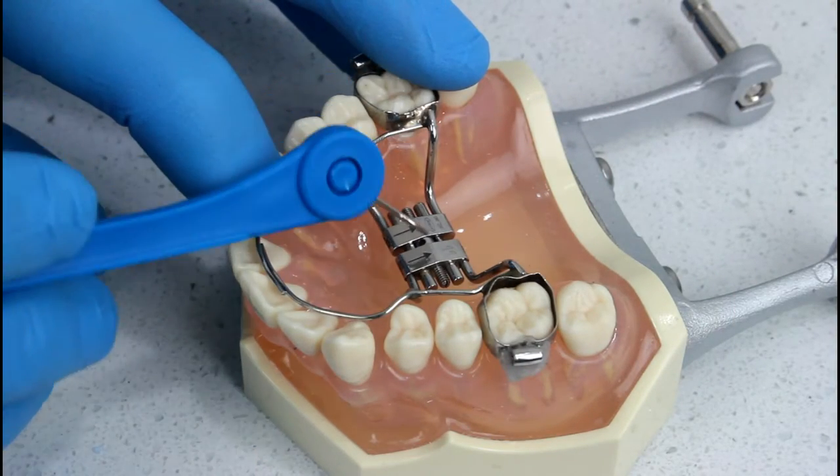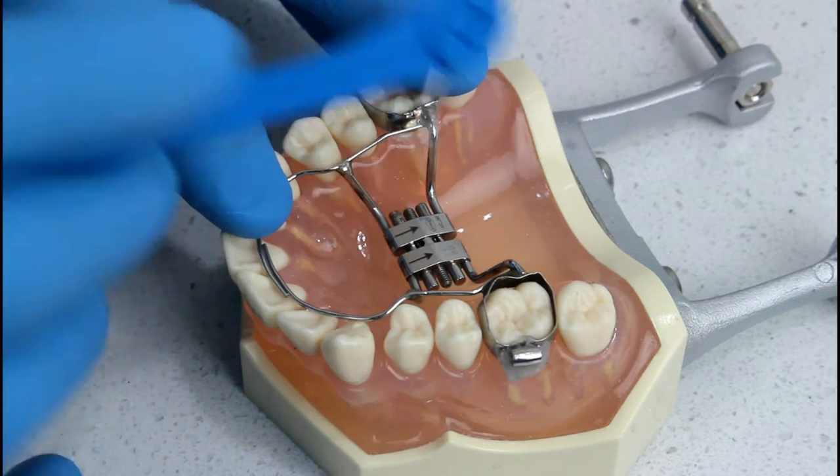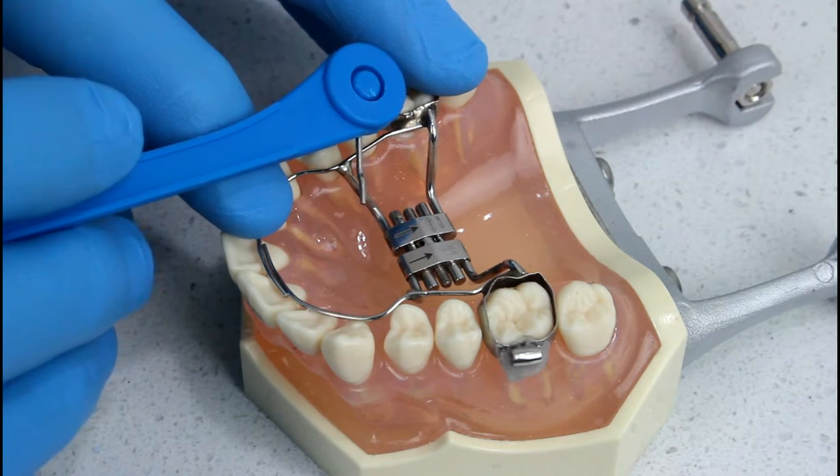When doing a turn, coming from the front of the mouth, you need to turn it all the way to the very back so that it hits the metal part at the back, and then remove the key going backwards.